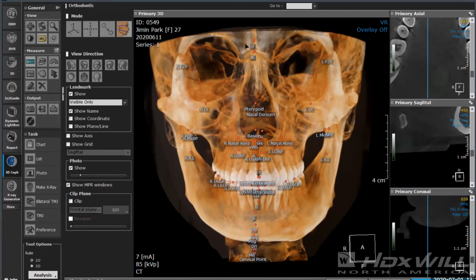So. Great. Is your machine manufactured in the U.S.? It is a South Korean company. We have warehouses in the United States. We have our North American offices. Again, we can talk more about this offline. But we've basically made it so that we have our items in the United States, so that we have easy accessibility. We have our own engineers to be able to provide service. We've done a number of different things to change the way the CBCT market is.